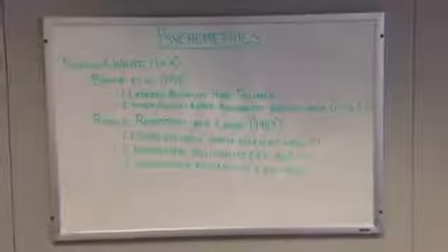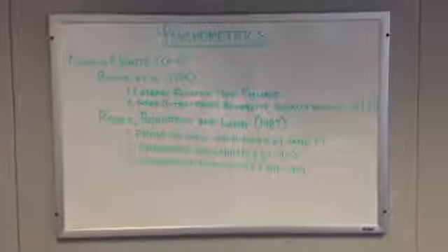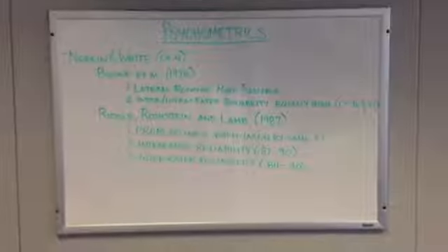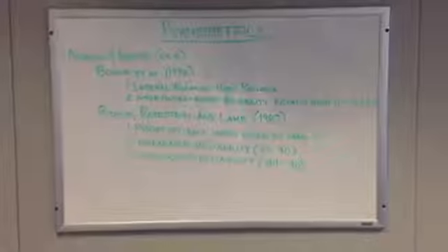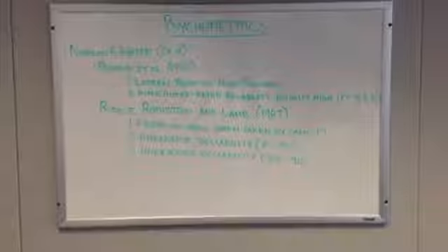Norkin and White provide several references in Chapter 4 for psychometric data regarding the shoulder complex. Boone et al. tested the reliability of several shoulder measurements, including lateral rotation, and it was found to be more reliable than other motions tested. Inter-tester and intra-tester reliability were almost equally high in lateral rotation, r equals 0.96 and 0.97.